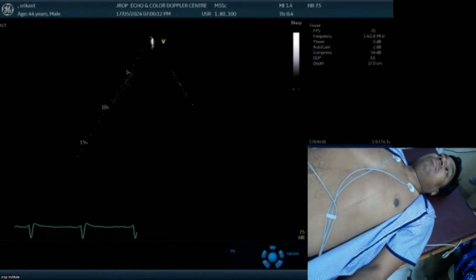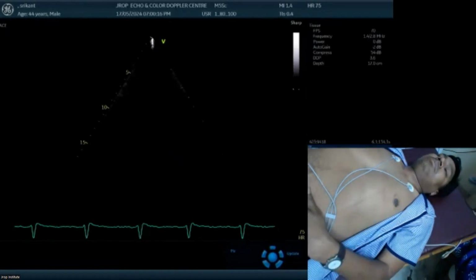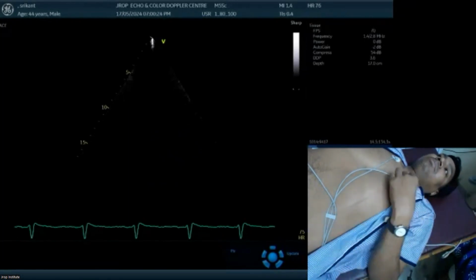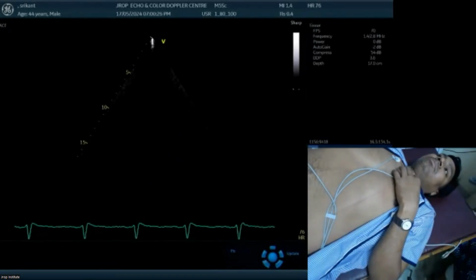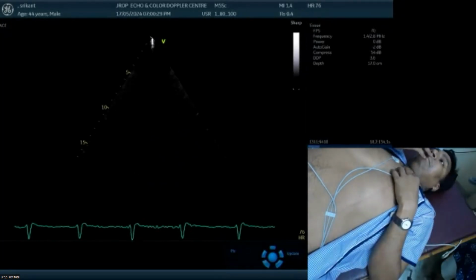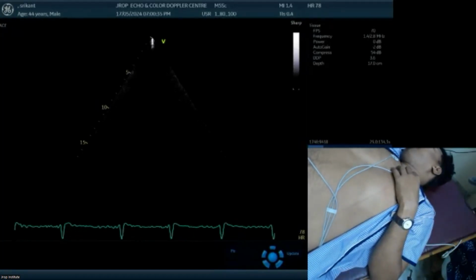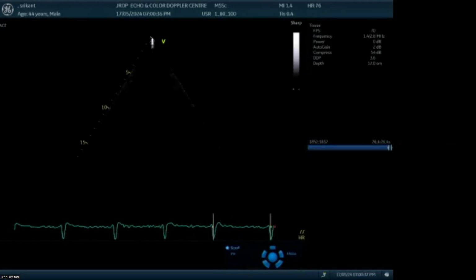Okay, so we have seen where we take out the flow velocity, where we keep mitral, aortic, and tricuspid flow velocities. Now again, questions. I've told you about colors, a little bit: blue away, red towards. Now the questions on whatever we talked about. Then I'll go to measurements for some time. I know it's a very boring topic, very difficult.